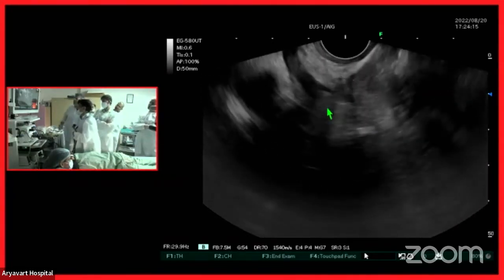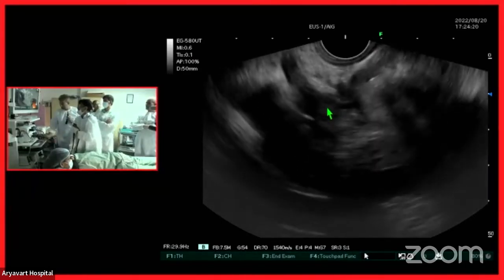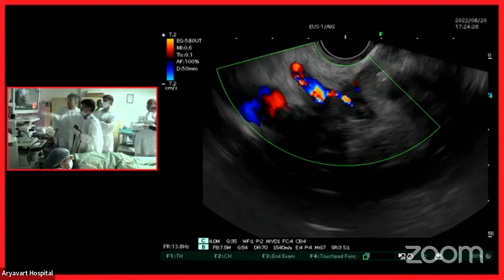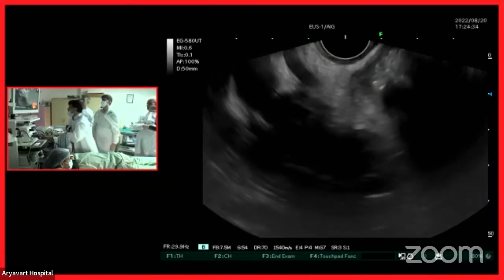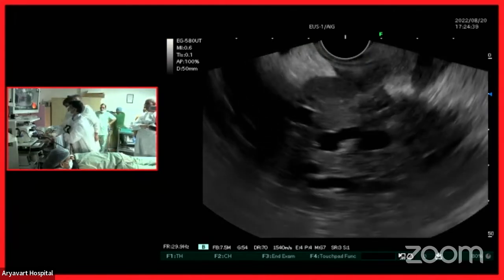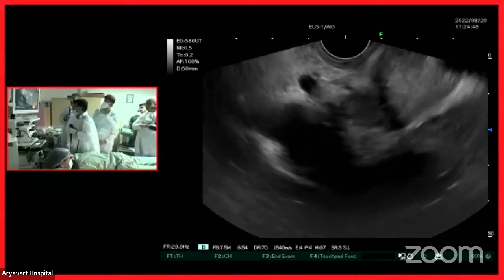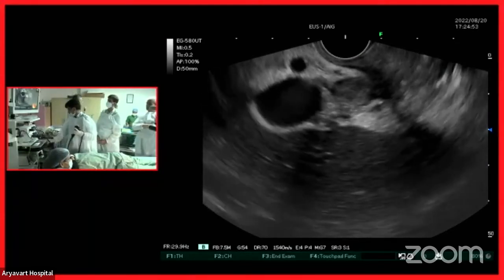Now, the only question is whether we can trace this. You have traced this mass above and below. If we trace this hilum, this is above, can it be the bile duct? I'm expecting to find the bile duct under the probe when I do my clockwise rotation, in the anatomy, obviously a little distorted here. So in this case, can we get the FNAC needle? Yeah, we can get an FNA from here.